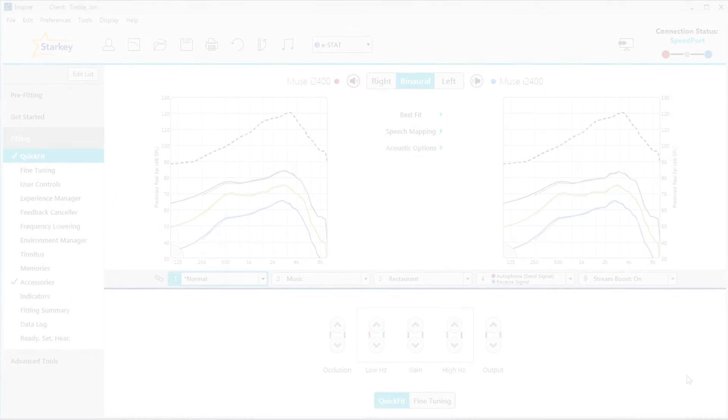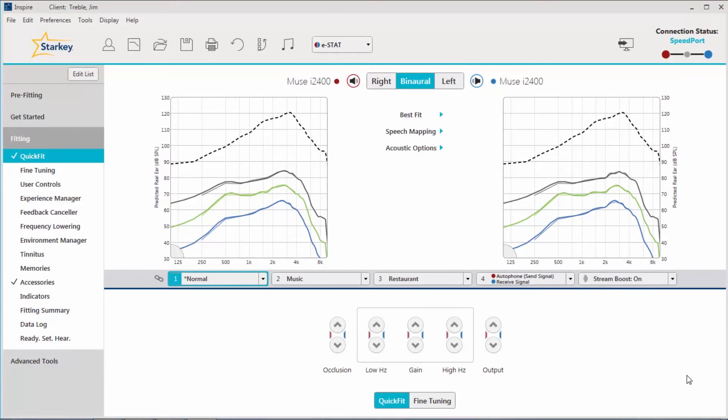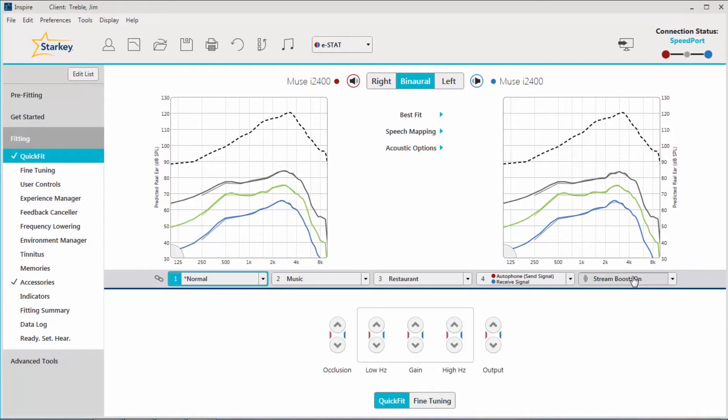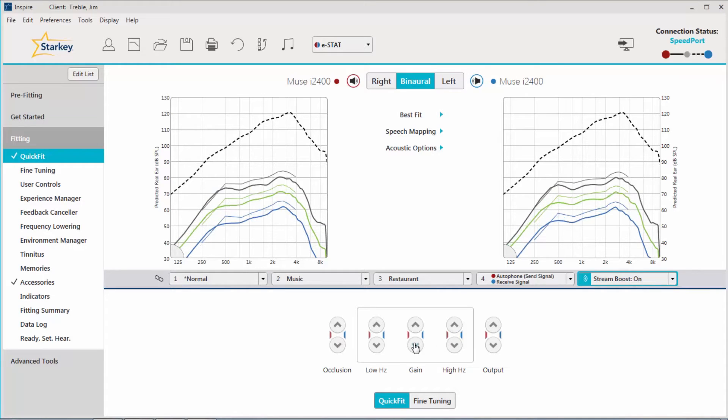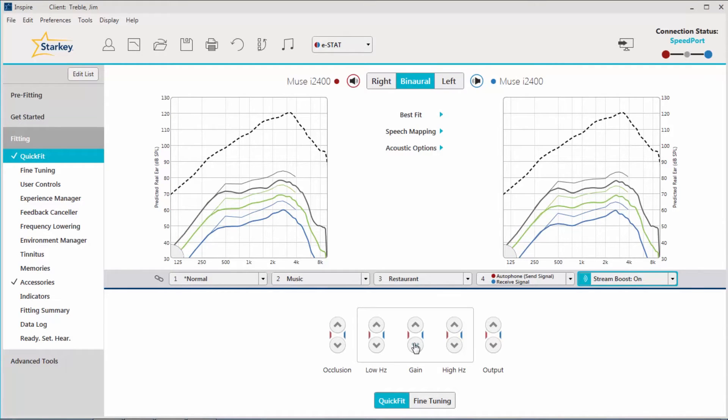Sound quality and volume preferences will vary from patient to patient. If the volume of a stream signal is too loud, there are a number of possible adjustments that can be made. One solution is to reduce the default volume of the StreamBoost memory. This is done within the Inspire 10 software. With the hearing aids connected to Inspire 10, click on StreamBoost and decrease the overall gain. This will result in a lower volume once streaming begins and the StreamBoost memory engages.